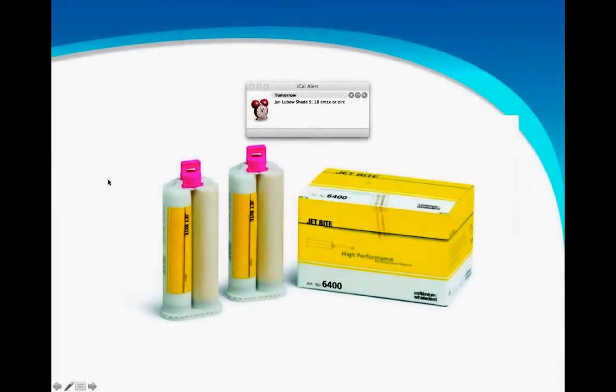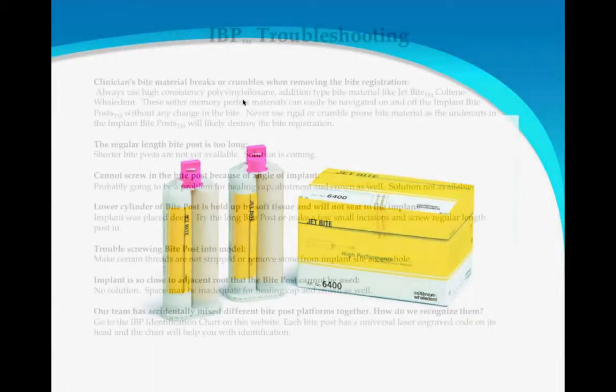Now let's talk about the material that you use. You must use a soft, pliable addition reaction silicone. If you use a blue mousse product or a brittle product, you'll have trouble getting it off without breaking it. Jet bite is ideal. I've seen other bites that work. I like this the best. But make sure that it is pliable.